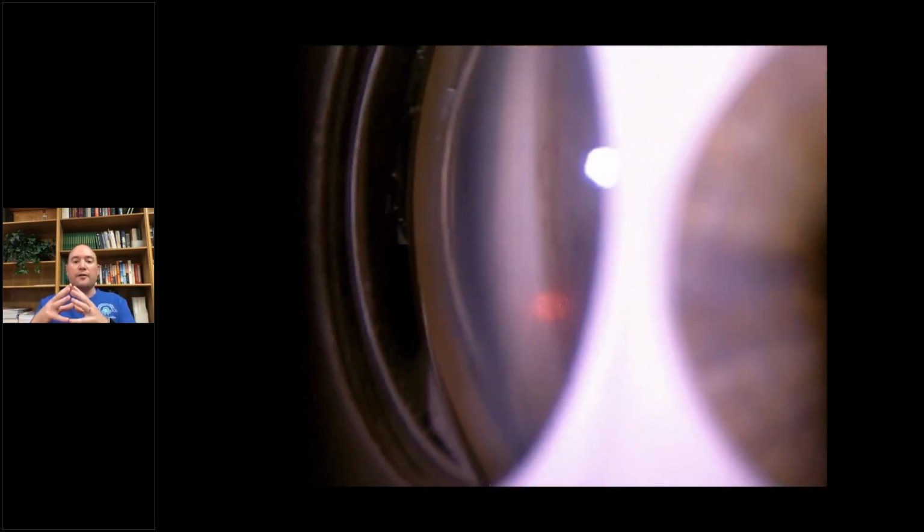And really the art of this procedure is the laser lens. It's tilting and turning and giving yourself the best view. Hone your gonioscopy skills. If you're comfortable with a gonioscopy lens and doing gonioscopy, you're going to be a whiz at SLT. Again, tilting and giving yourself direct access to the trabecular meshwork. Notice we're 3 mirrors in already. We're working up our 4th mirror. We have not rotated at all yet.